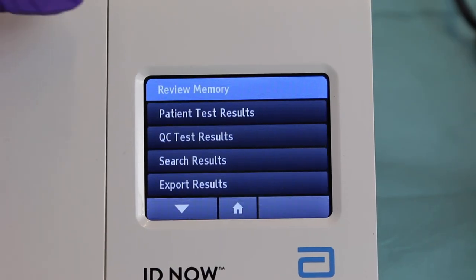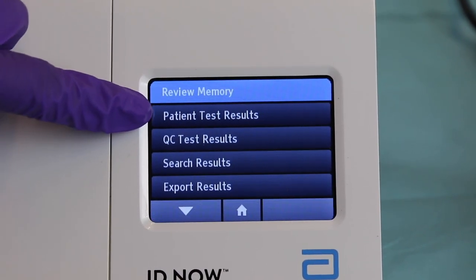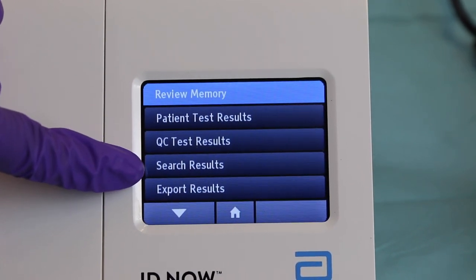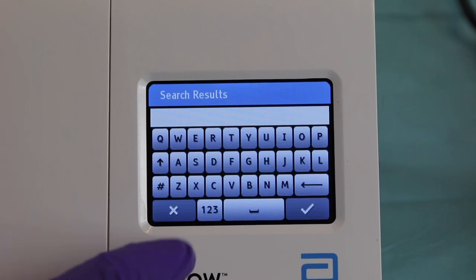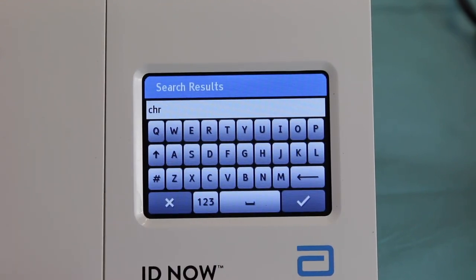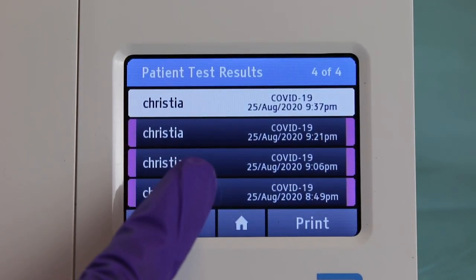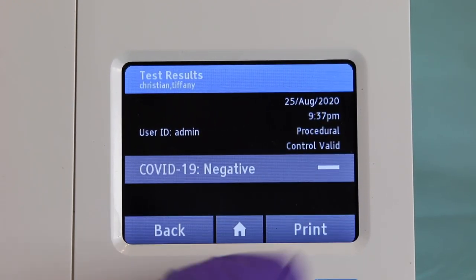The Review Memory tab is for reviewing patient results or searching quality control test results. To review a patient's test results, hit 'Patient Test Results'. If a patient came in and lost their results, go to 'Search Results', which allows you to type in the patient's last name to search. You'll be able to see exactly when those patients came in, whether they were negative or positive, the date, the time, and you can print that up.